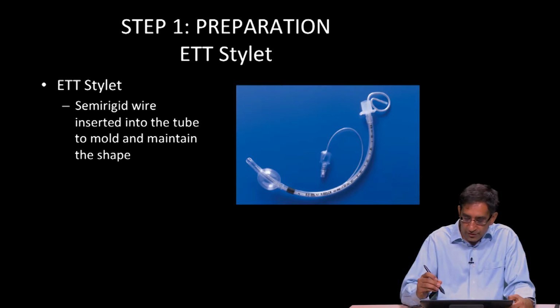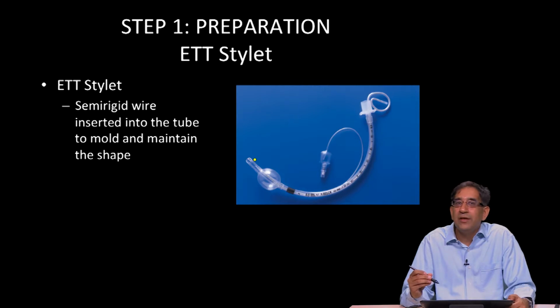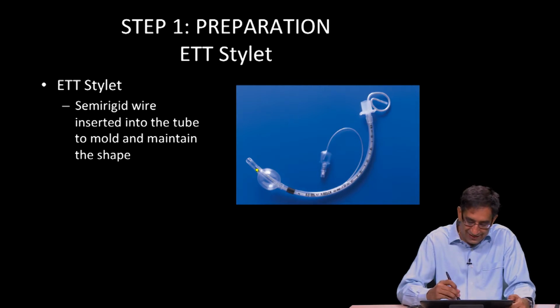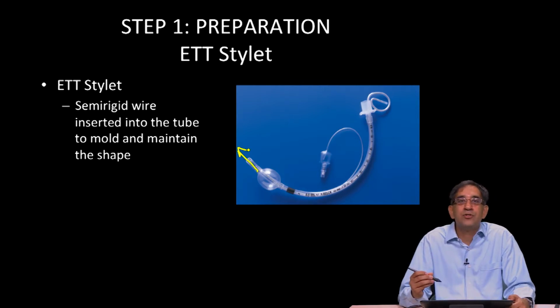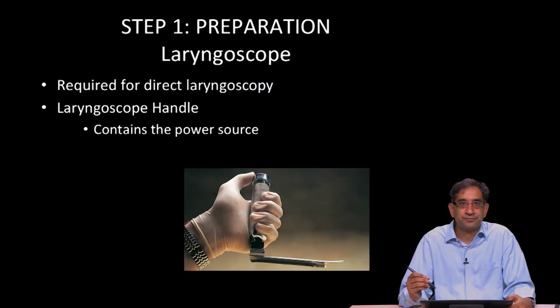An endotracheal tube stylet, as seen here, goes within the endotracheal tube and gives it shape. So it molds the endotracheal tube into any shape that you want. It can keep it rigid. What's really important, though, is that it doesn't stick out beyond the endotracheal tube itself. This is very important because it can injure the patient if it's sticking out. So make sure that it resides within the endotracheal tube.